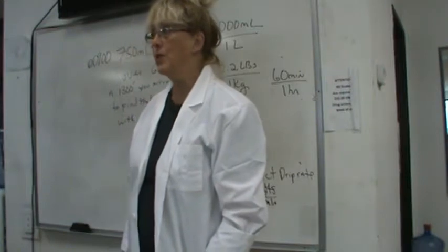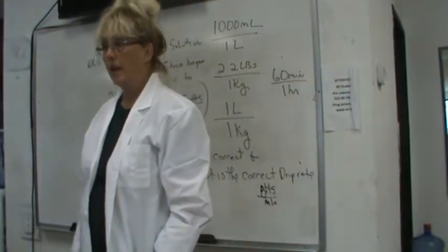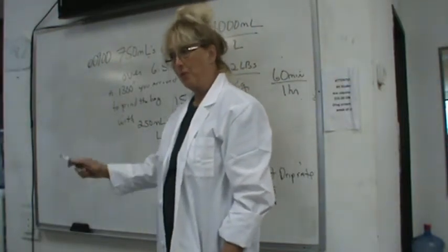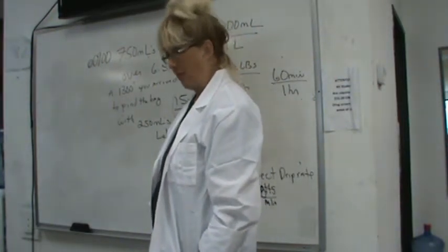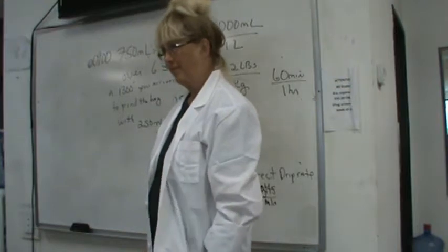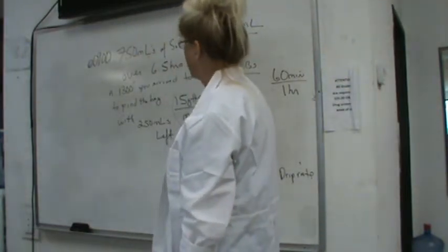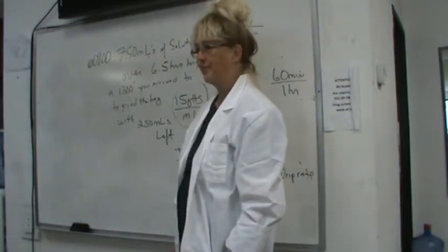That's something we as nurses have to do regularly. It's crazy. When we walk into a room and everybody's on a gravity drip, we have to recalculate to make sure that their drip rate's flowing normally. It is crazy. It's insanity. But it's okay. You get used to it.